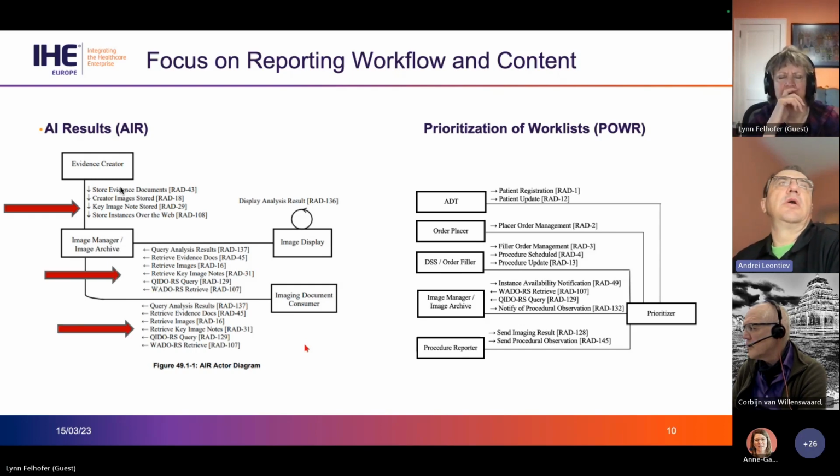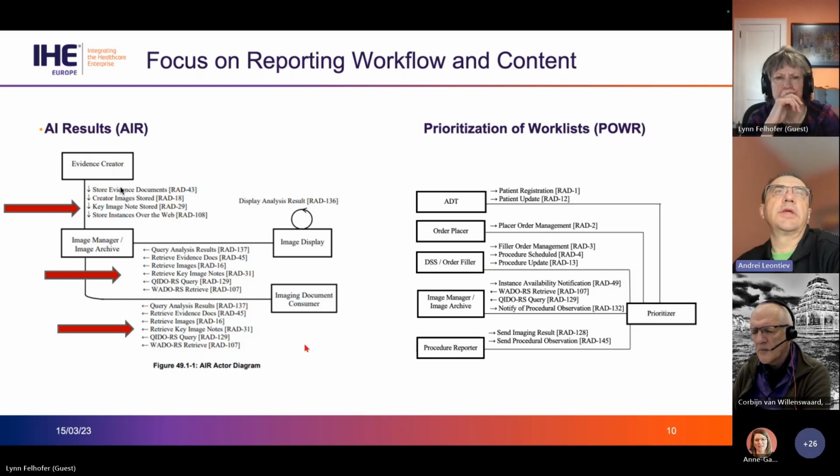Yeah, thank you. AI Results is the older profile which has been, I believe, tested at the Connectathons. It was created earlier, but I'm mentioning it here in terms of highlighting the fact that AI results are becoming an indispensable part of workflow and the content of diagnostic reports.